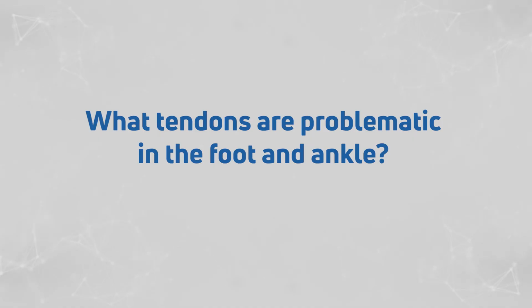So tendons in the foot and ankle that seem to be problematic, the two main ones that come to mind immediately are the peroneal tendons and the Achilles tendon, both of which can be very variable with the amount of healing. With peroneal tendons, one of the main things we deal with a lot of times is reconstructing or repairing, say, a longitudinal split tear. And the tendon may still be intact, but it's degenerative. There's mucoid degeneration, there's hypertrophy of the tendon. So you're going in there and trying to sew this split tear back together, and it's already a thick tendon.